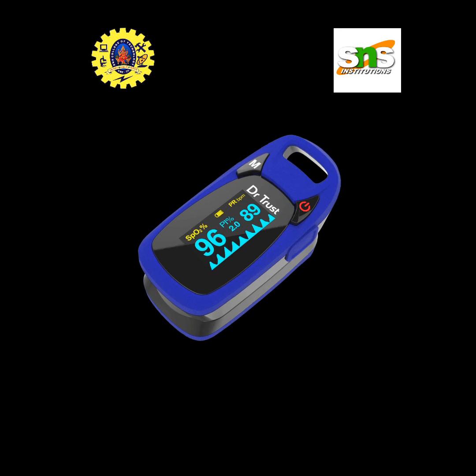But one thing should be remembered: factors such as movement, temperature or nail polish can impact the accuracy of the pulse oximeter. So that's all about the mechanism of the pulse oximeter.